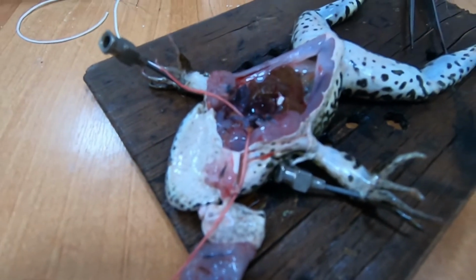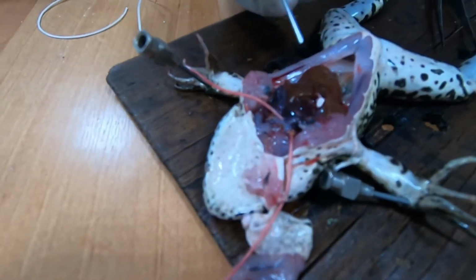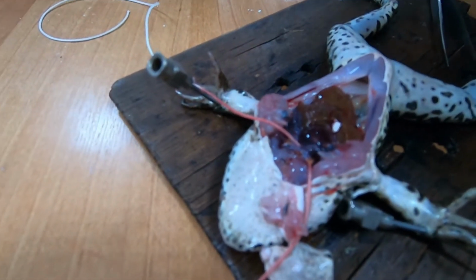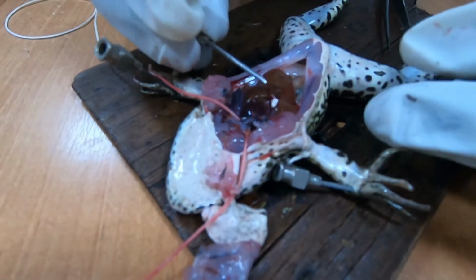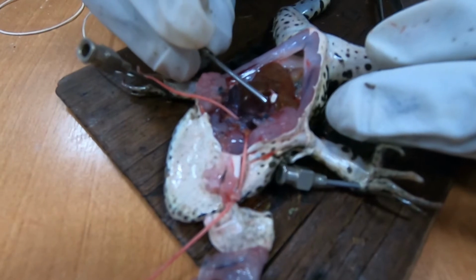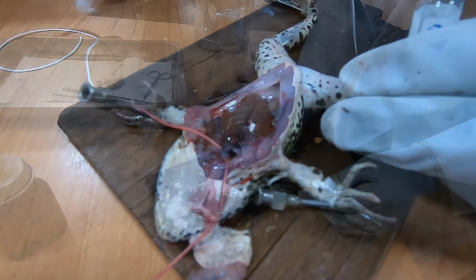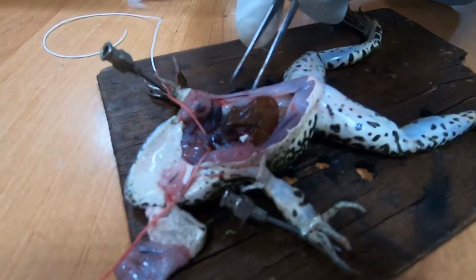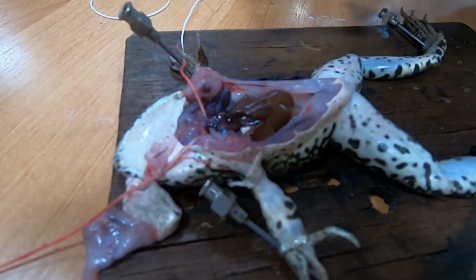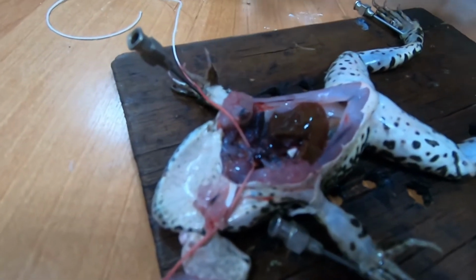Maybe it's not enough. Maybe it's right. And then we do a little bit of what we call massage of the heart. So you can see we have added some adrenaline and the heart has restored its normal systoles and diastoles.